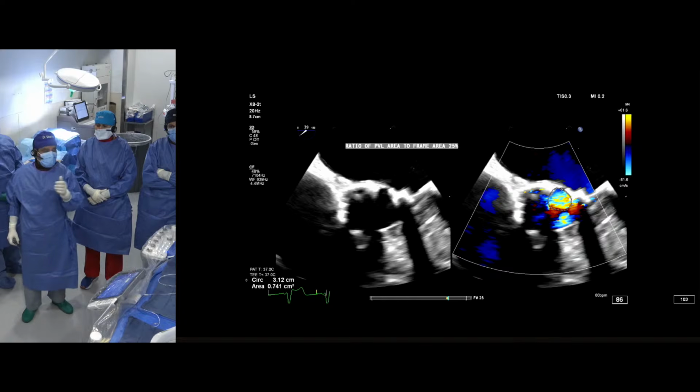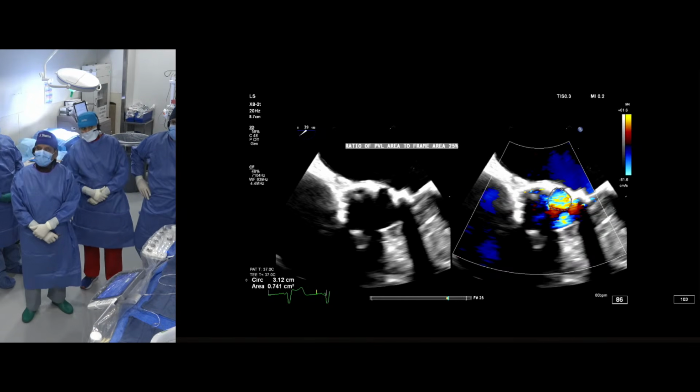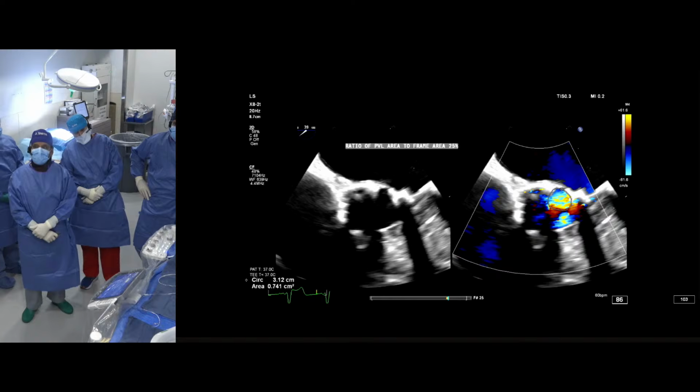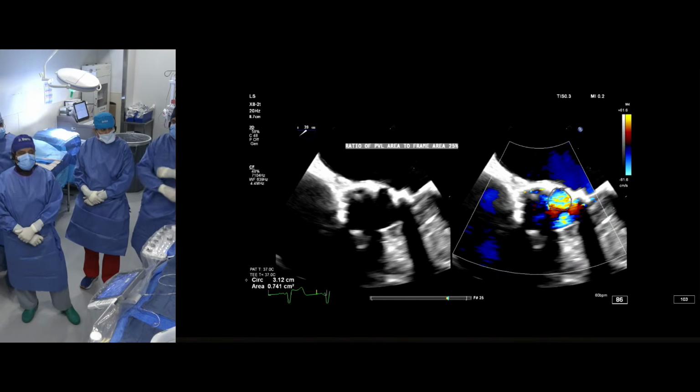Or second, could we have done a second valve at that time, knowing that with the PVL, the diastolic pressure was okay, was not low in that particular case? So the question is, a second valve at that time to eliminate that PVL completely, and secondly, should we plug them?